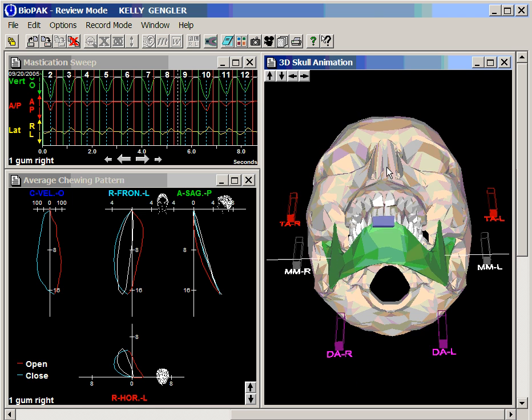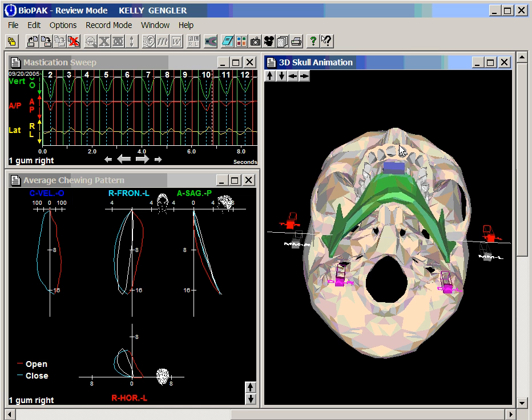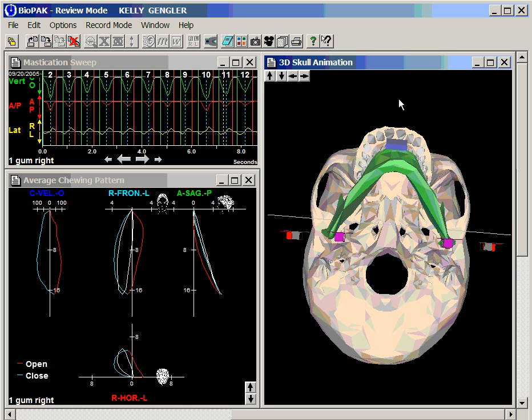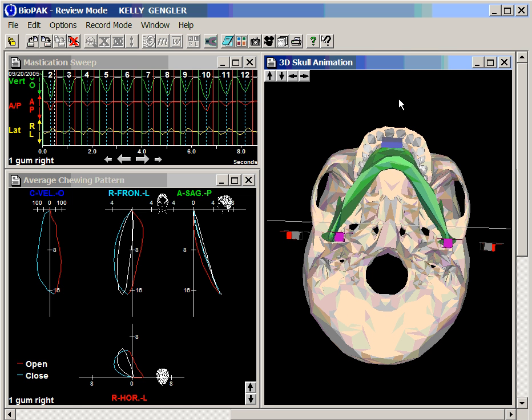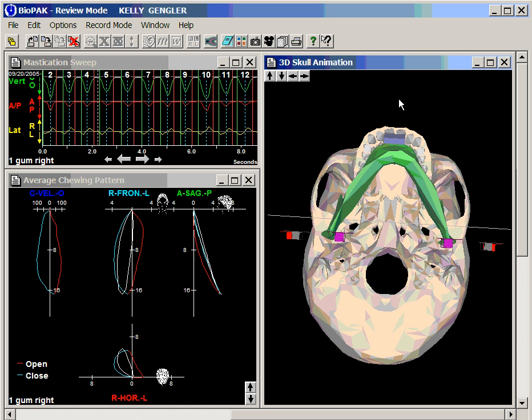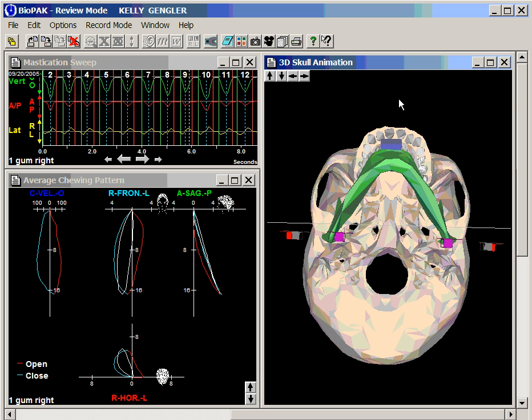And then we can also look at a horizontal view and see the mandible functioning as the patient is chewing gum on the right side.